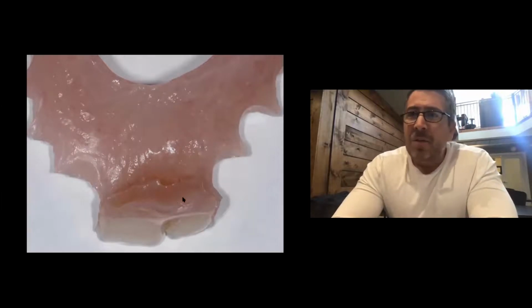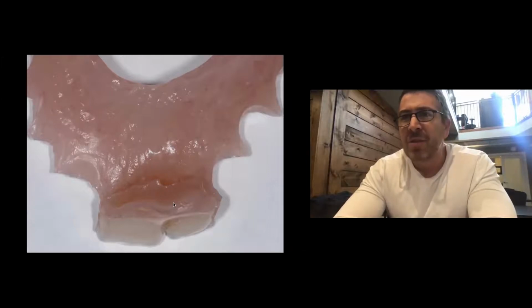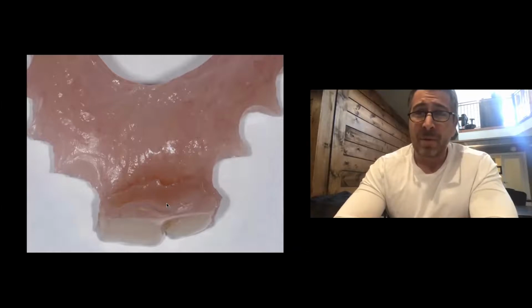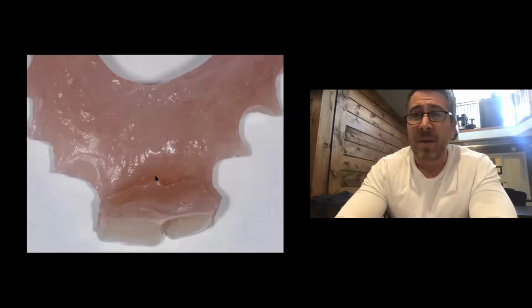Your prosthetic tells you a lot. So if you look at her prosthetic, and here's her flipper, whatever the pink is, that's tissue that's missing. So if that tissue is missing, it's not going to be there if you place the implants in today. So look at your flipper, analyze the thickness of the flange, and look at the amount of vertical pink that's there, because that's what's missing and that's what you need to surgically reconstruct. And again, that comes down to the understanding as a restorative doctor of what can be accomplished surgically and what can't be. And you need to engage with your surgeons, if you're not doing your implants, to talk to them about what their predictability factor is for different types of augmentations.